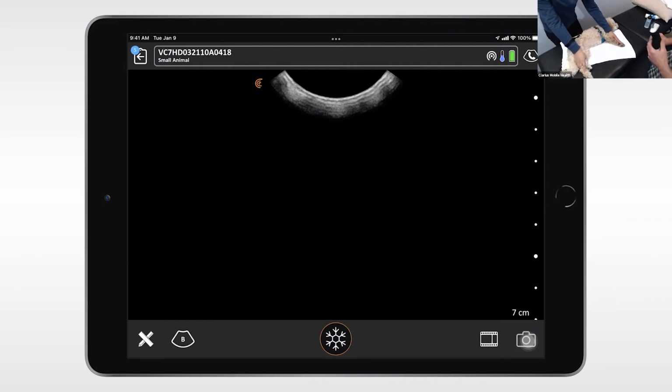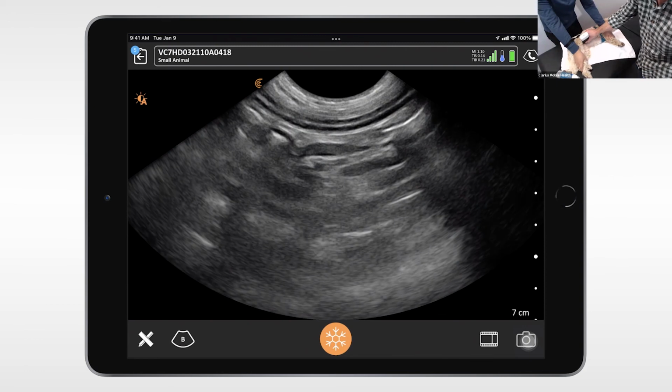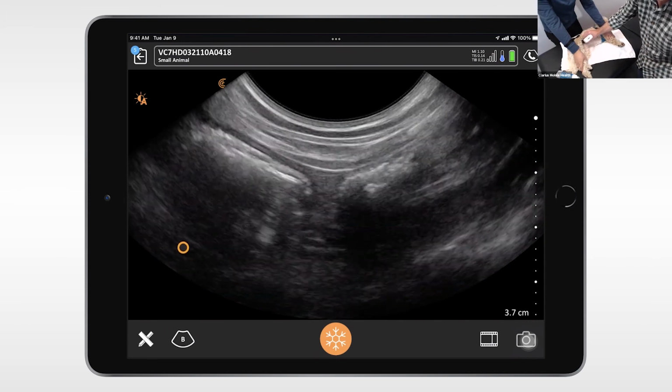I'm going to try. I know we feel the ribs where they meet the dorsal musculature somewhere around here. We're going to put a little alcohol, right? Spread the fur. And then put some gel. Plenty of gel, plenty of alcohol. Plenty of gel, yep. And we're going to scan. Okay. And I'm going to try and find the duodenum. Is that the duodenum at the top of the screen? Yeah, that's there at the top there. Okay, or it was. Okay, let me see if I can get it back.